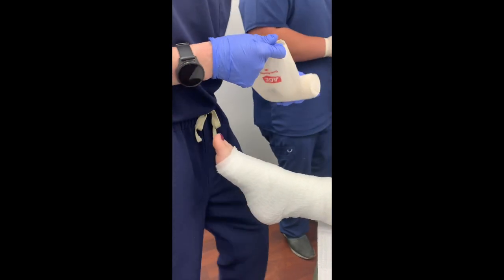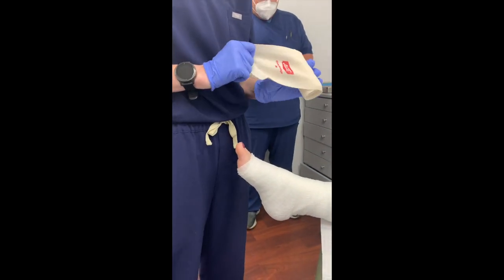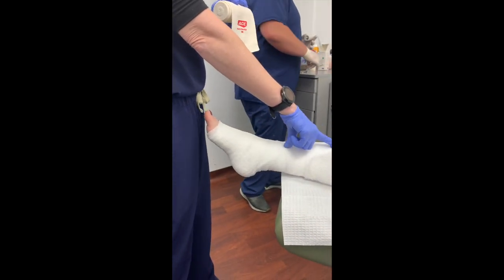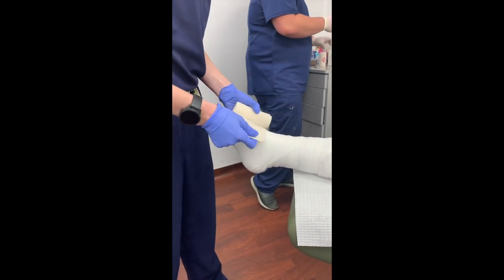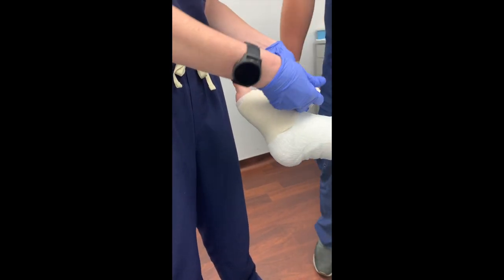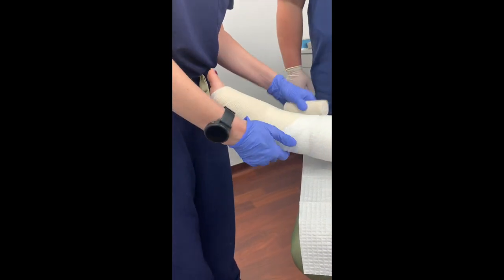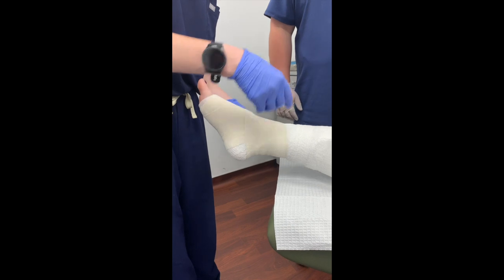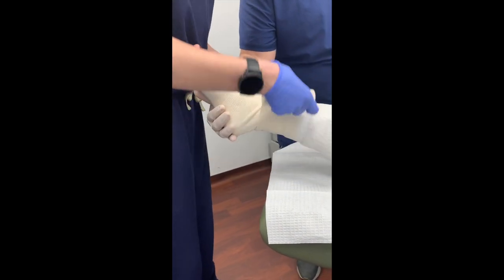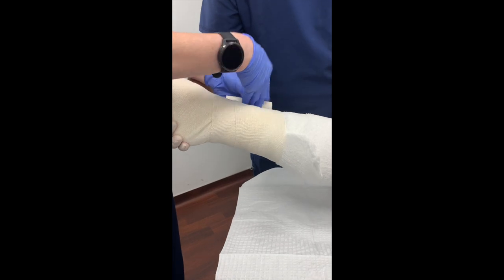For the ace bandage layer, I'm going to use a four-inch ace bandage. Sometimes you can use a six-inch. Four-inch is easiest for the foot and ankle; you can use a six-inch for the calves, or double fours. Around and up — this is where you're going to get most of your compression. I usually puff the forefoot once and then come up and around that ankle. Then around and up, around and down, around and up, around and down, around and up, around and down — you get this nice herringbone pattern.